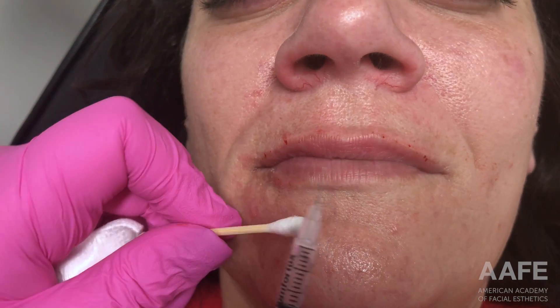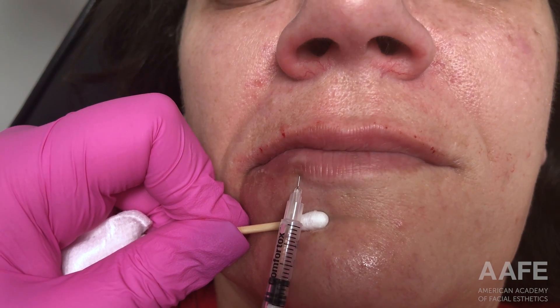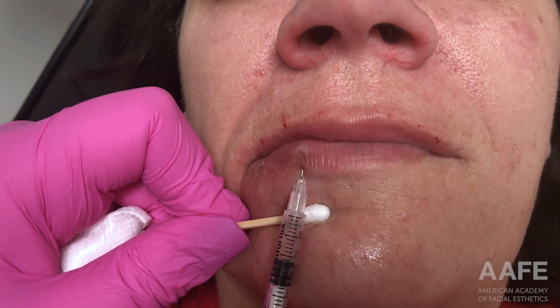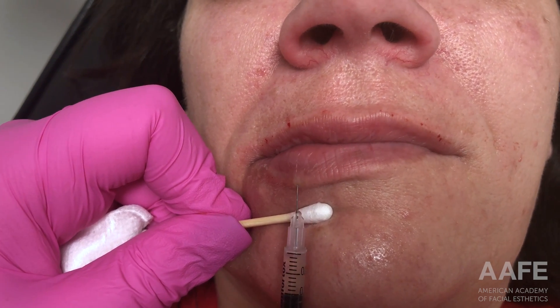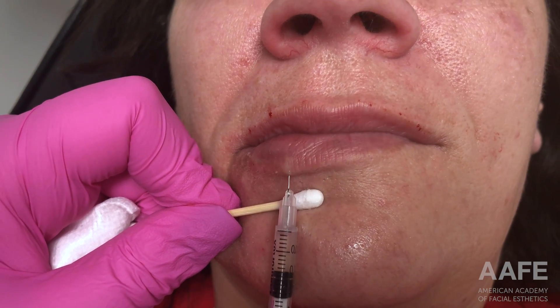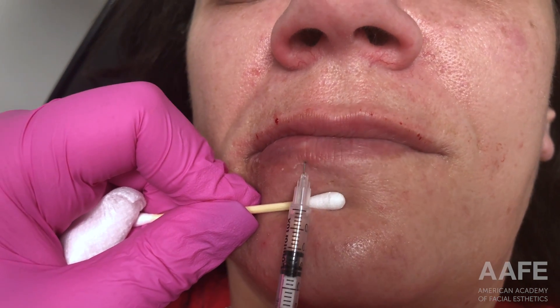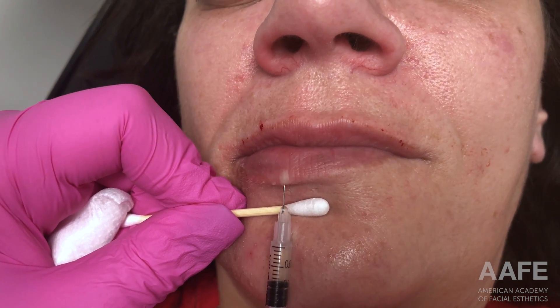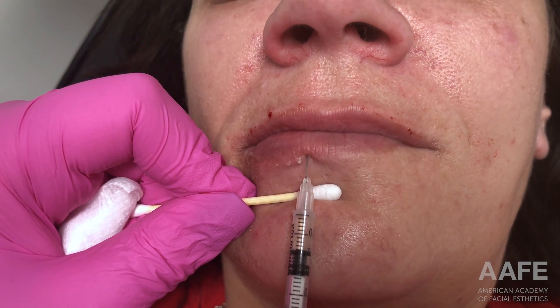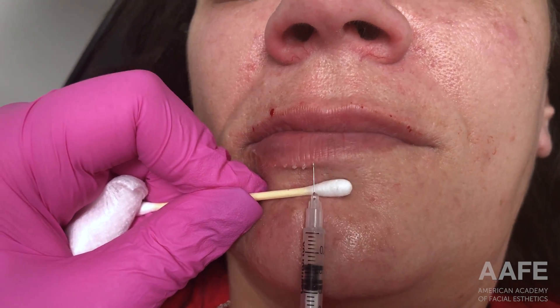You can see I did that AFE right-angle technique across the entire top lip, which definitely helped in lifting the lip up and creating more space to work with — creating more lip show. Lip show is how much of the lip you see when looking at the patient straight on, as opposed to lip projection, which is what you see looking at the profile: how far out the lips protrude or project outward.